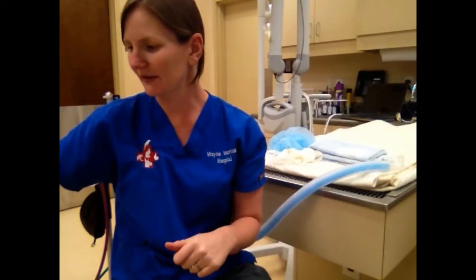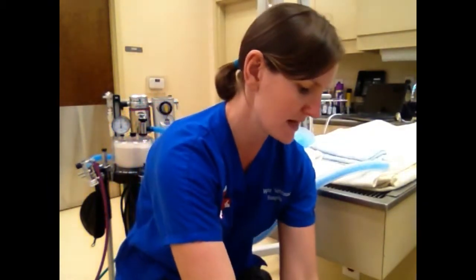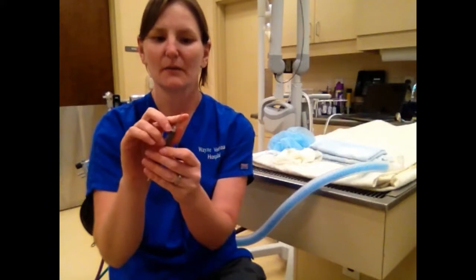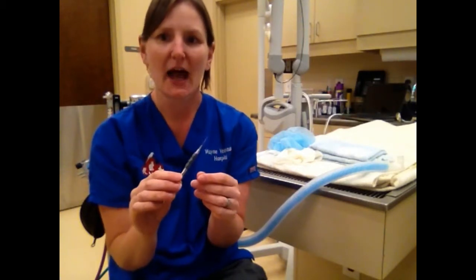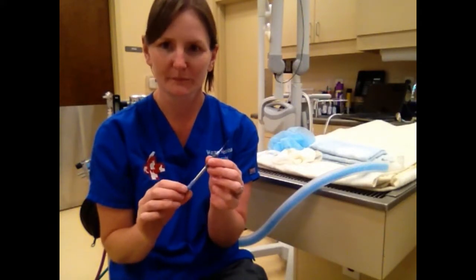Once the large chunks of calculus have been removed, we go ahead and scale the teeth. There's two ways we can do this, with a manual scaler, which I have here, or with an ultrasonic scaler, which I also have just down here attached to my dental machine. Scalers have three sharp sides and a sharp point at the tip, and they're used to remove calculus from the teeth supragingivally, so from the tooth itself, not from under the gum line. We use these in a sweeping motion down from the crown to the apex of the tooth to remove the calculus. We would use the manual scaler in conjunction with the ultrasonic scaler.